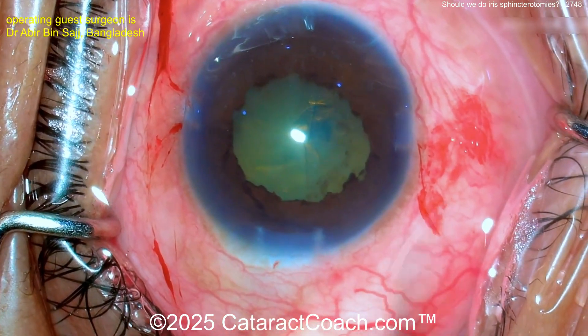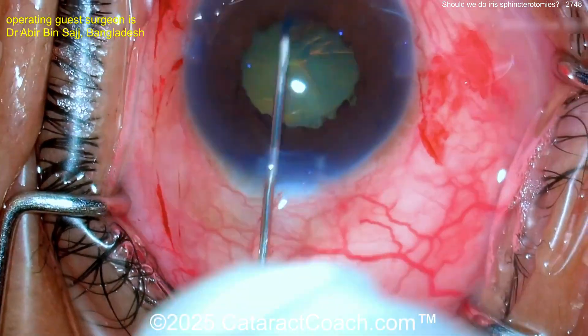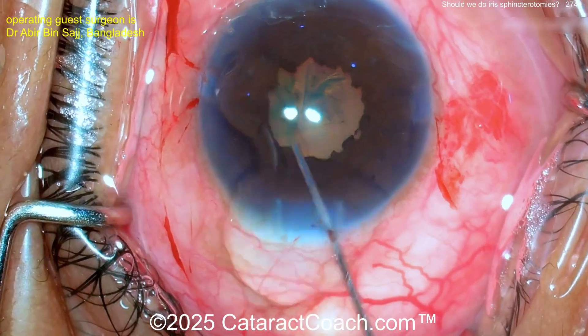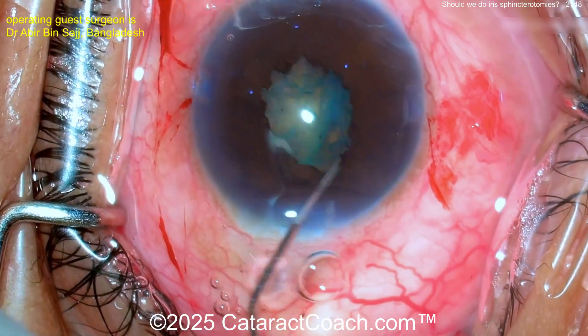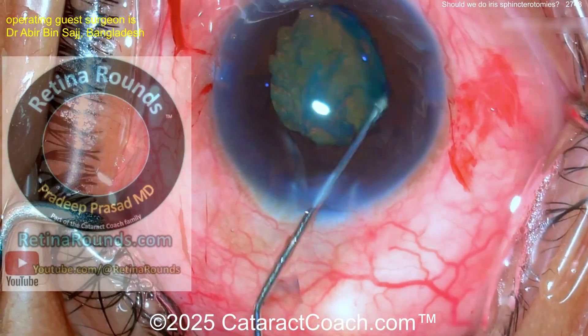Let's see what happens getting the rhexis done — you can see the pupil keeps coming down. This is where you may want to use a different viscoelastic to keep the pupil more expanded as you complete the rhexis. My technique is to prolapse the lens partially out of the bag and have the iris hold the lens for you. Let's see what the surgeon does here.